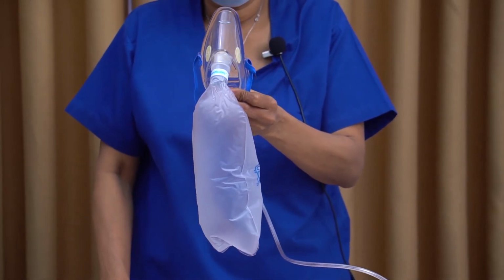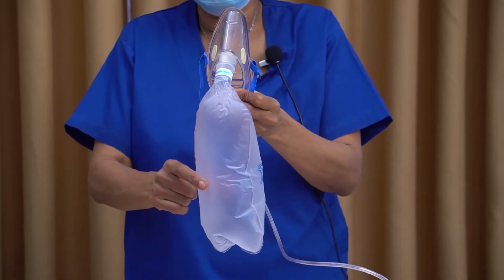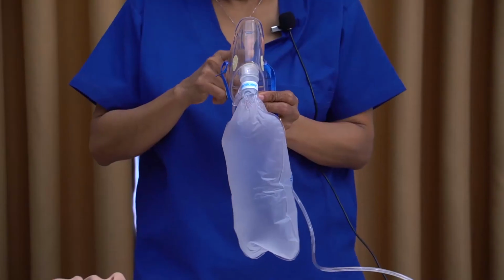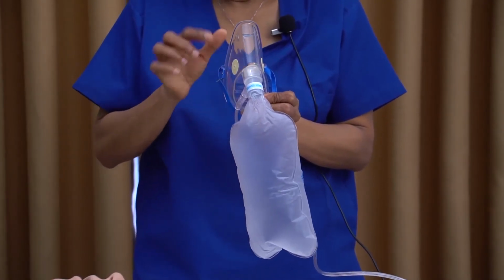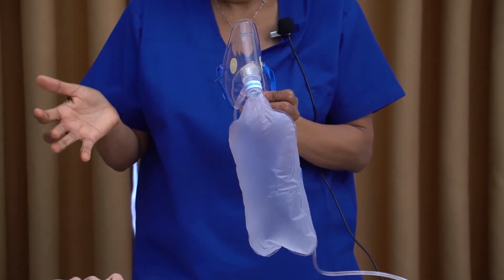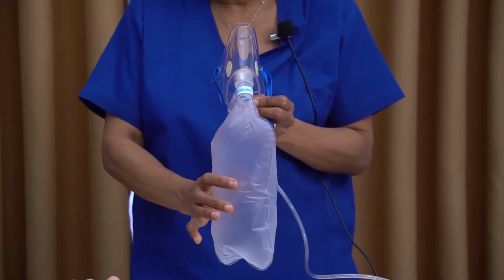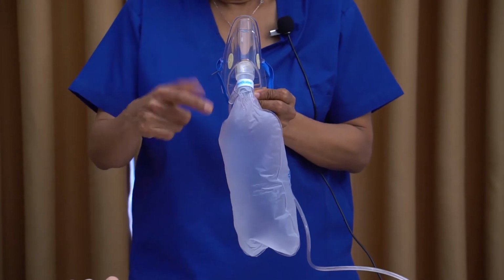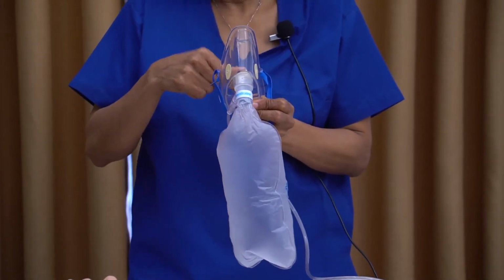This is a non-rebreathing mask. This consists of 3 parts: reservoir bag, face mask, and valves. When the patient breathes out, exhaled air is vented through these 2 one-way valves to the outside. When he breathes out, the oxygen delivered gets collected in the reservoir bag. With the next breath, oxygen collected in the reservoir bag is inhaled by the patient.